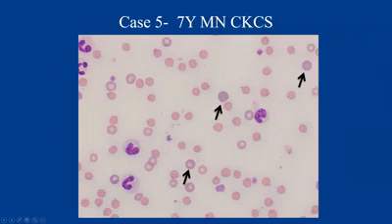You may think that this patient is regenerative because there's polychromasia here, but based on our analyzer, it actually is not, and sometimes that just happens. Other findings, we've got a platelet here, and a platelet here, and a platelet here. Okay, so platelets are fine, even based on the analyzer count. And then if we look at our white cells, I see a segmented neutrophil here, but then I see these other neutrophils that don't have that nice segmentation.